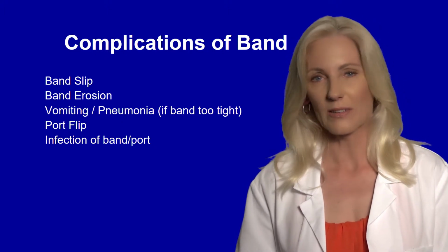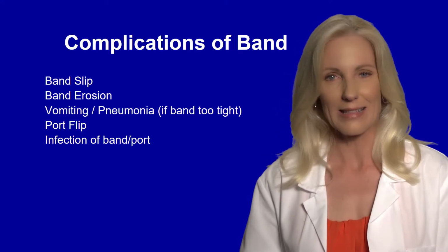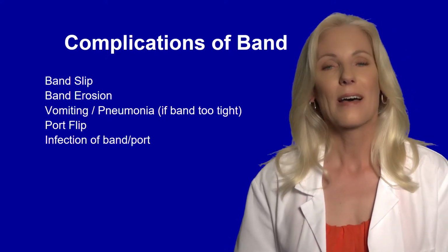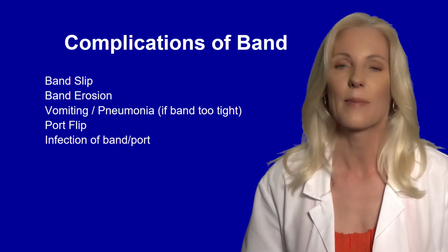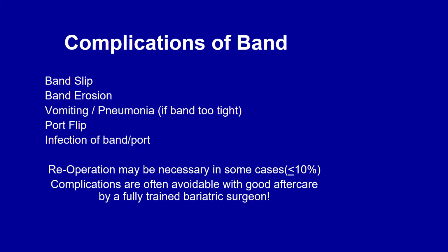The port, which is the little piece under the skin that the needle goes into to make the adjustments, just from scar tissue, it might be pulled sideways underneath the skin. If that happens, it's a pretty easy operation. We just open up the same incision, put the little port back down flat, and you're fixed. But like any foreign body that's in your body for any reason, it could get infected and may have to be taken out. So reoperation may be necessary in some cases, but many complications, and this is true of all the surgeries, many complications are avoidable with good aftercare from a fully trained bariatric surgeon.